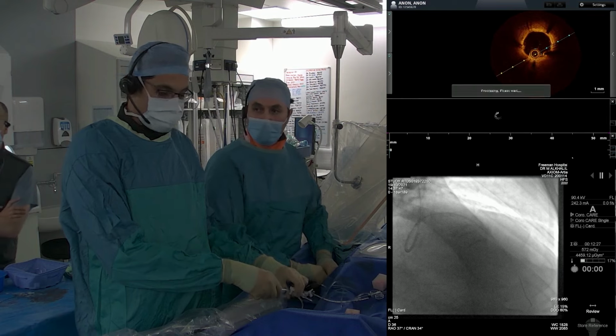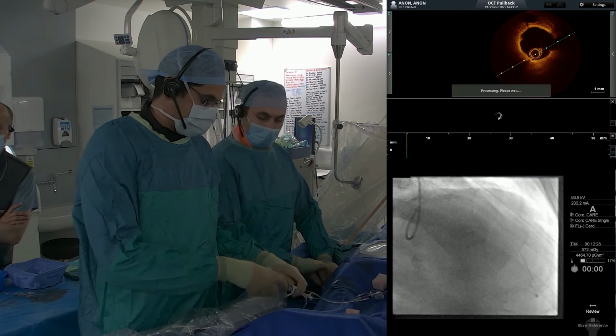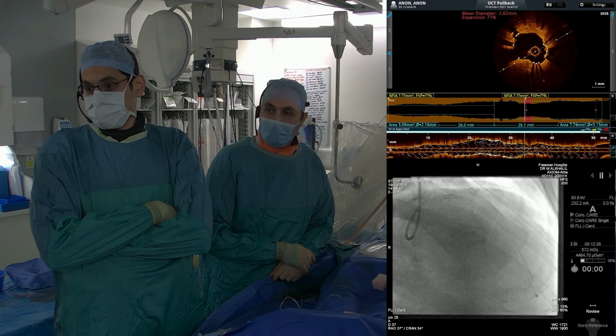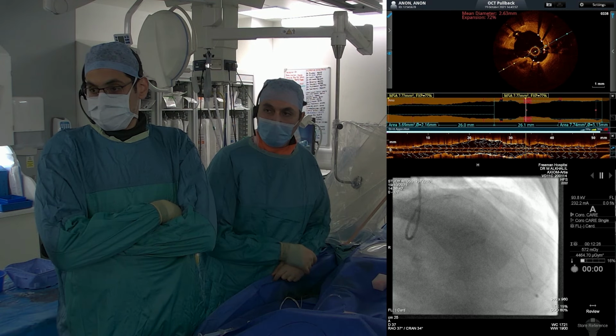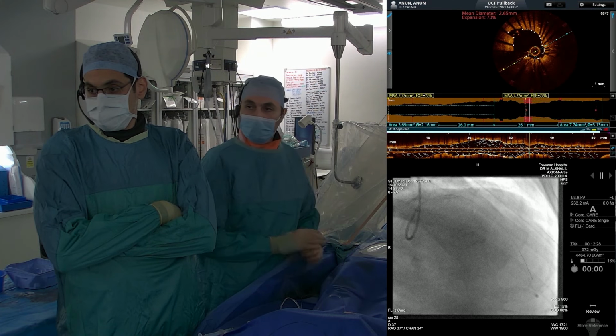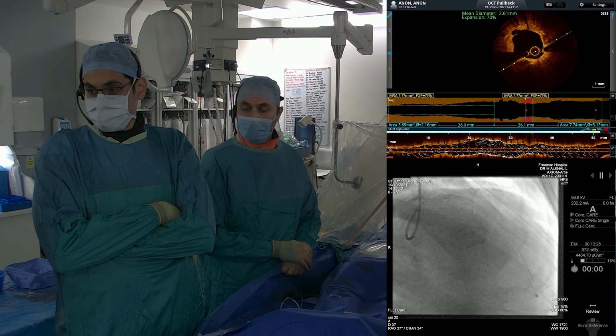Now you can see the vessel properly after. So I'm just going to take this OCT out. Here we go. Okay, just stop. Go slowly there. So there we can see the 2 layers of stents. Go back. Yeah. And we can see the neointimal hyperplasia that has been crushed between the 2 stents and expansion of the original stent. The stent's slightly underexpanded here, which I think we probably should go back and post-dilate.